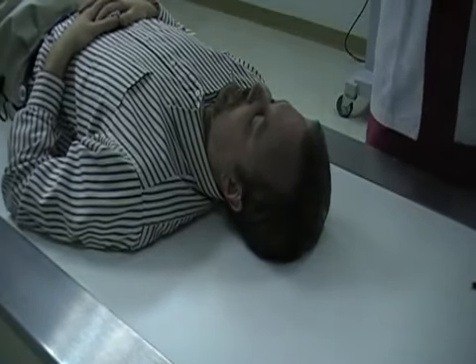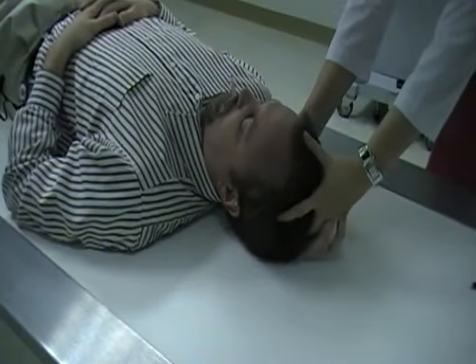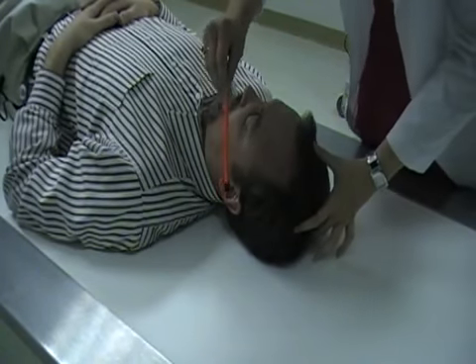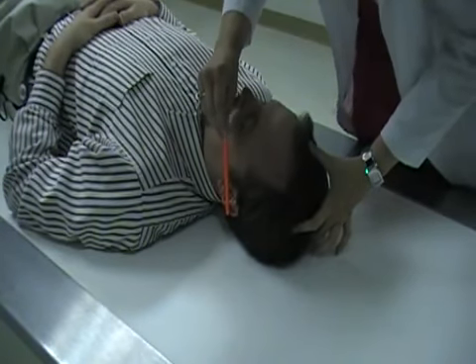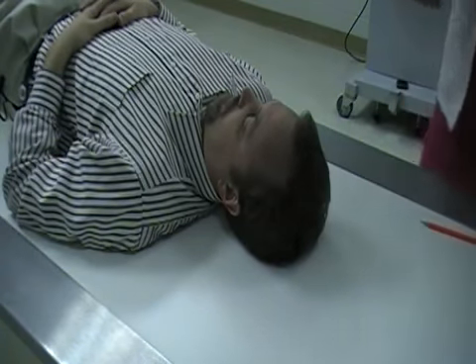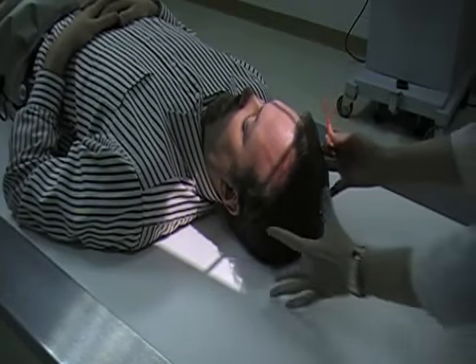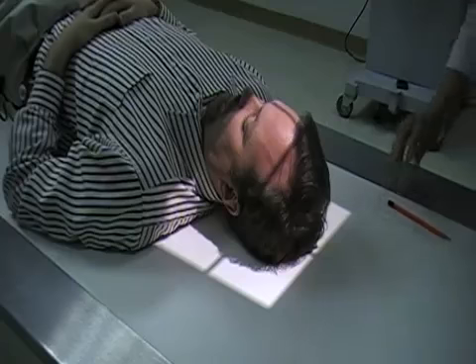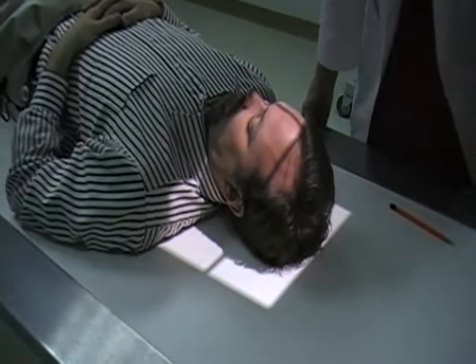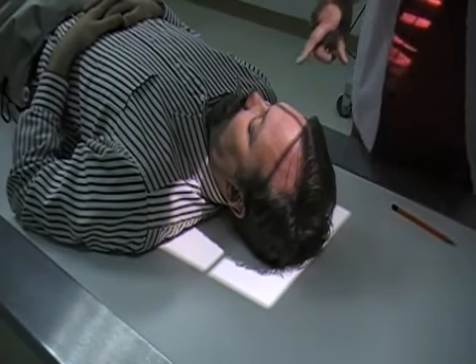Alright, positioning for the cranium, I'm going to do the Towne method. You need to have your patient's chin ducked down because we're going for the orbital meatal line going perpendicular into the table. So make sure your patient holds that ducked chin. Double check, make sure that your mid-sagittal line is going vertical. And then our central ray is going to enter 2.5 inches above the glabella.